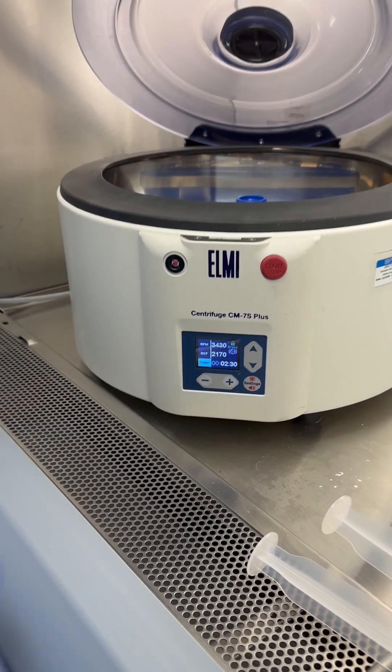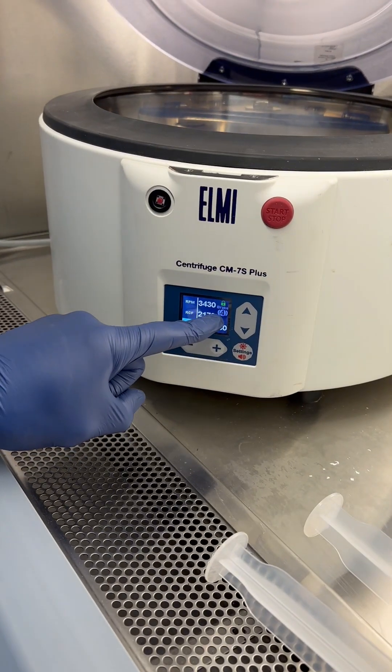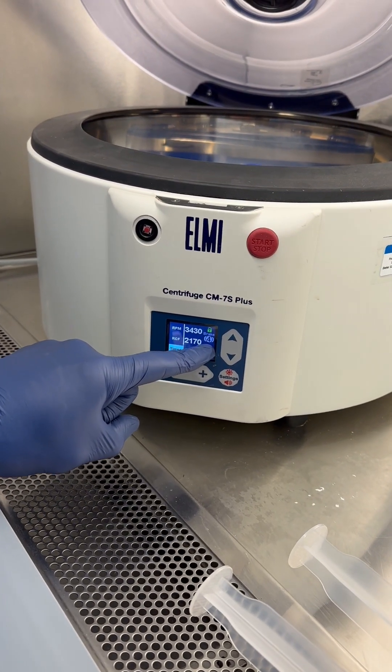Two and a half minutes is our first spin. The brake is set on four — make sure you set the brake on four.